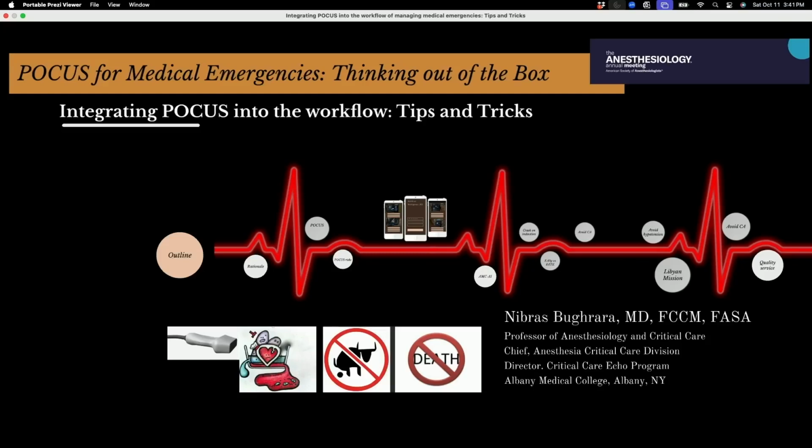One of the questions we asked was, is point-of-care ultrasound or critical care ultrasound useful in patients for cardiac arrest? And we looked at patient-important outcomes. And our recommendation was you could use it or you could not use it. The data that's out there up until now, like you say, is conflicting. Why do you think that may be?